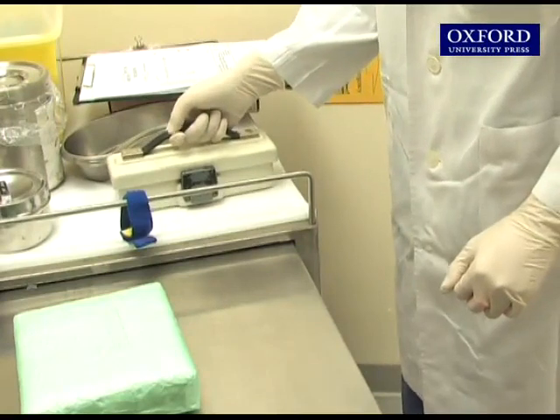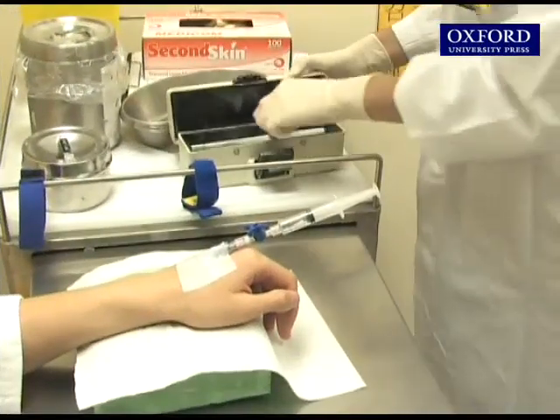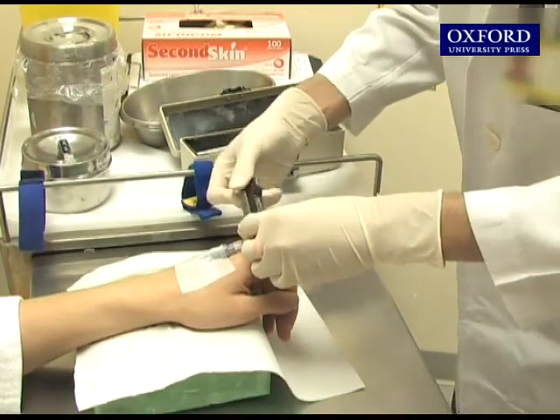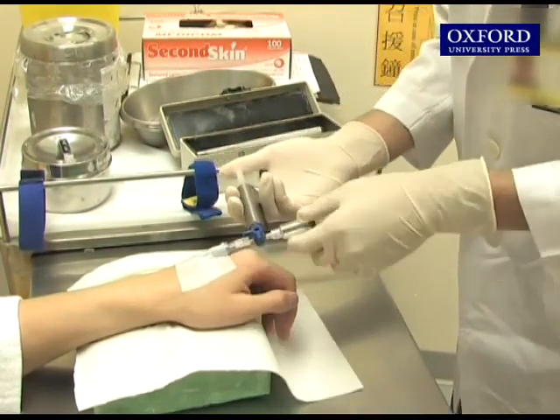The tracer is placed in a lead protective box when it's transferred from the storeroom to the patient. This helps reduce radiation exposure. Similarly, lead-covered syringes are used for injecting the radioisotopes.